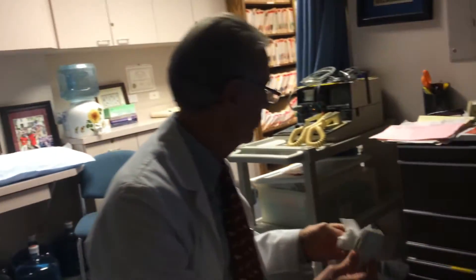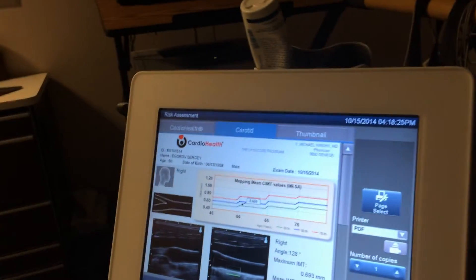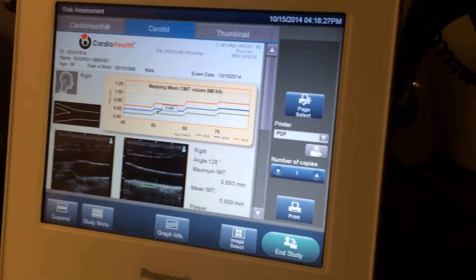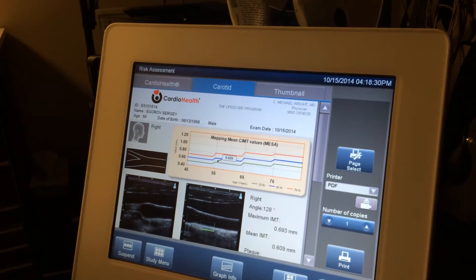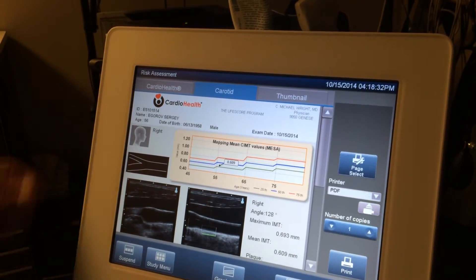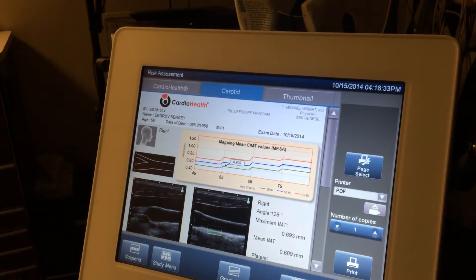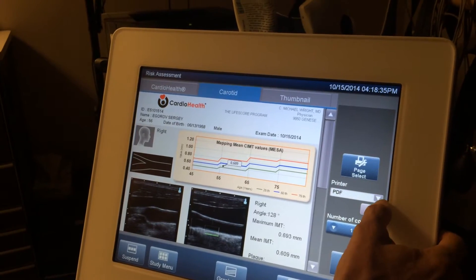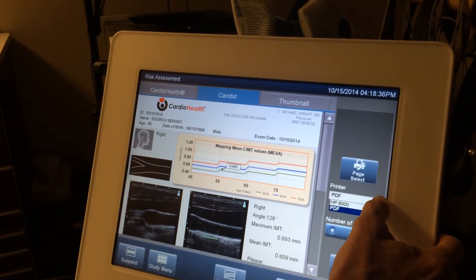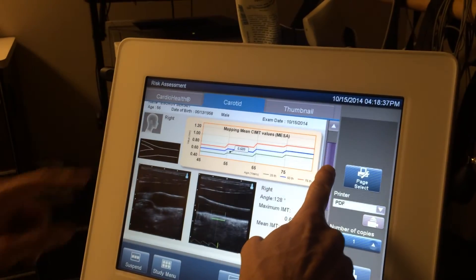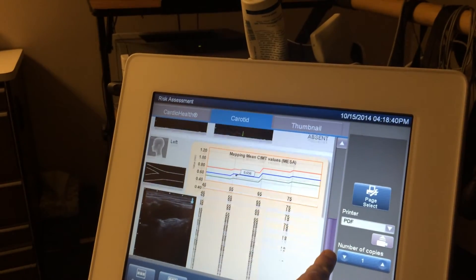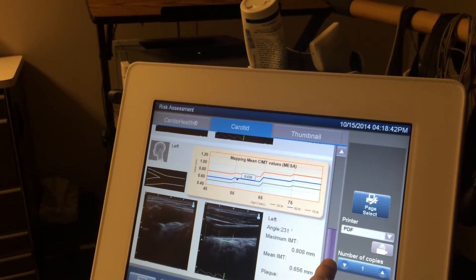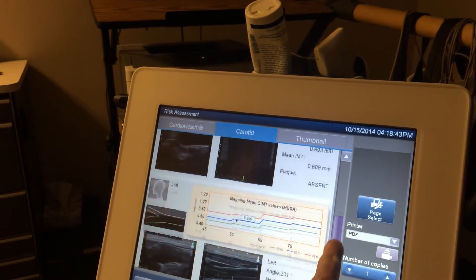So here's the report. And we can also print this out for you. The top half of the report is your right carotid artery data, and the bottom half of the report is your left carotid artery data.